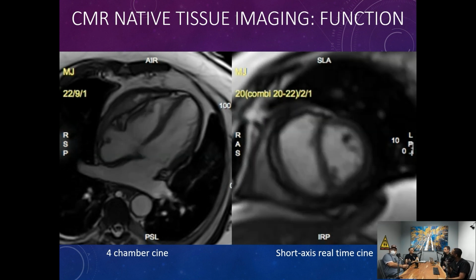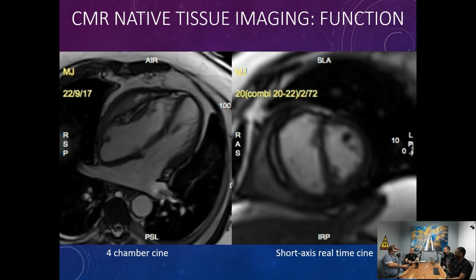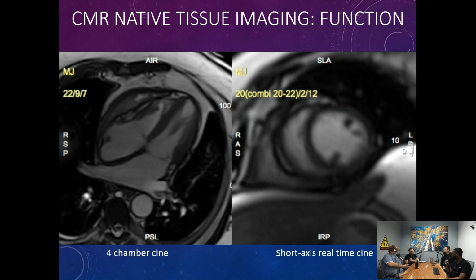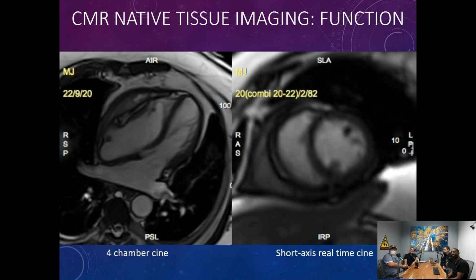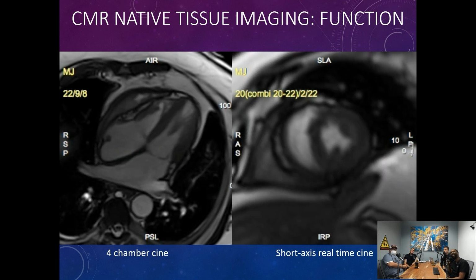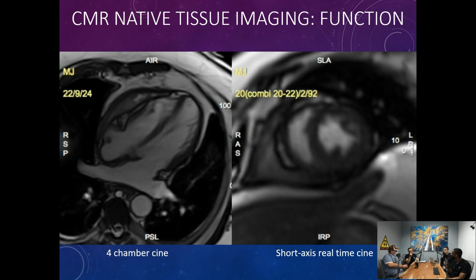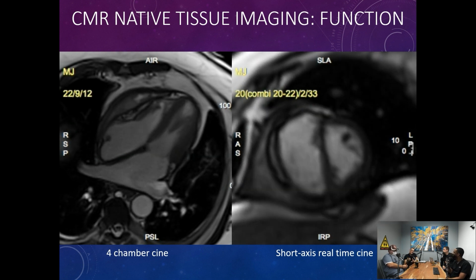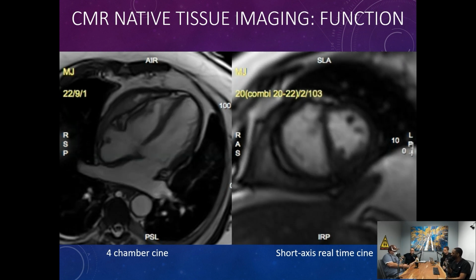But this exemplifies some of the strengths of 3T. I compared it to riding a bronco versus riding a nice service horse. The 3T is much more challenging for the technologist because you've got to get your off resonance frequency right and reduce your dark band artifacts and stuff. But once you get that, the smoothness of the myocardium on the left is really quite nice. I've got other images later that were acquired on 1.5, and you'll see the signal to noise ratio is obviously more of an issue.